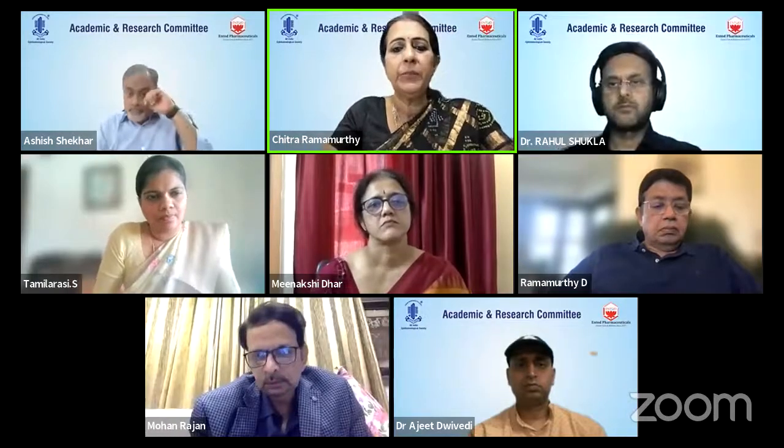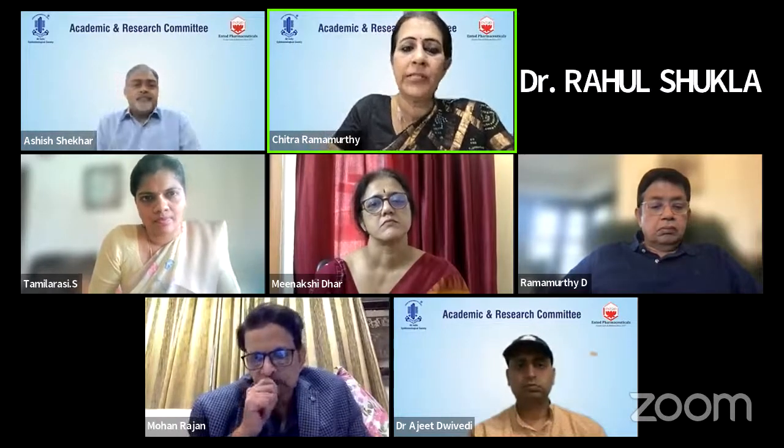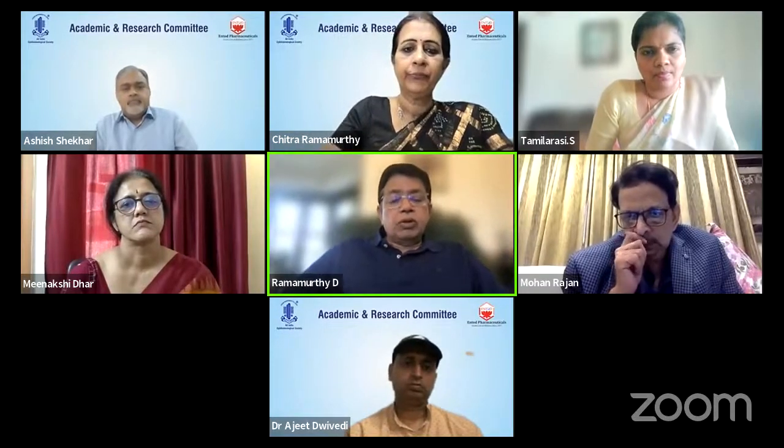Dr. Gaurav or Dr. Ramurthy, I just wanted to ask you, does it make sense to have placed a single piece IOL as a scaffold at all? If you have decided on a scaffold, probably it should only be a 3-piece IOL. No, I think scaffold should not have been done at all.